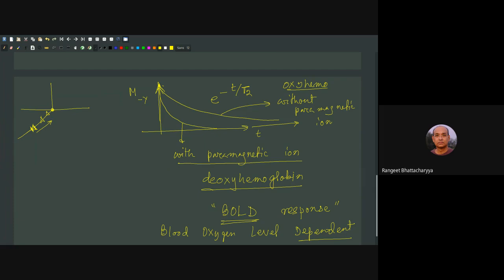But what you see is almost always not the raw signal. Almost always the contrast is calculated by subtracting some base value. The net result is oftentimes the skull shows up not as a black line, it shows up as a bright line. So the difference is highlighted.